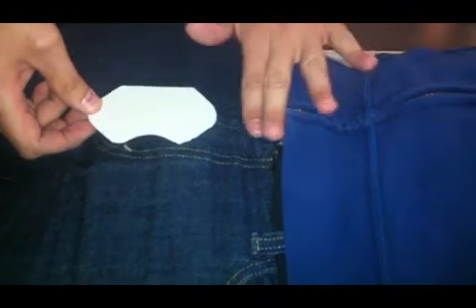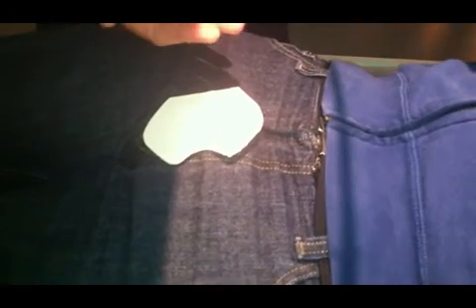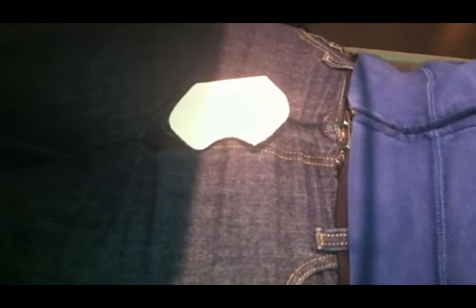For guys, the symphysis, a little bit of pressure here. Right here, put your shield just sitting on top there. I'll put a piece of tape or whatever to hold it in place. You can do that, it's fine. But it should just rest on there.